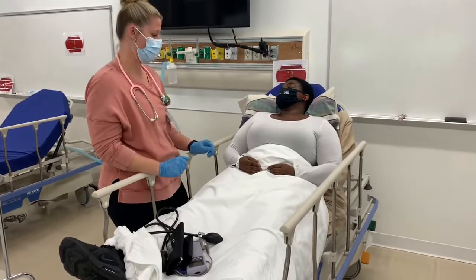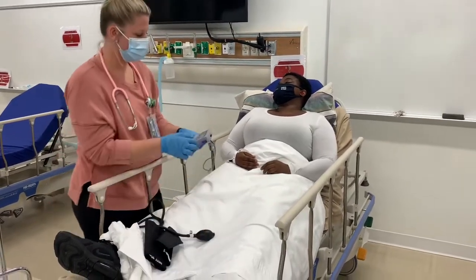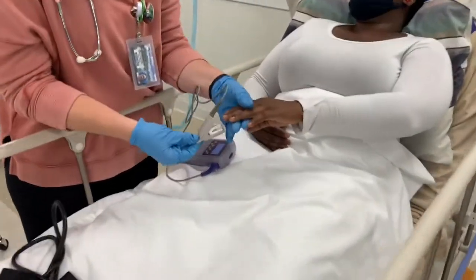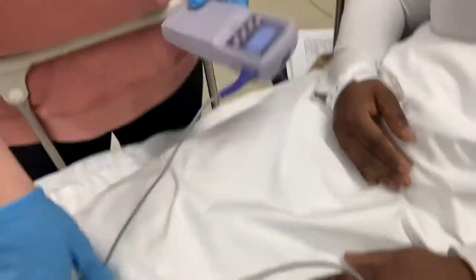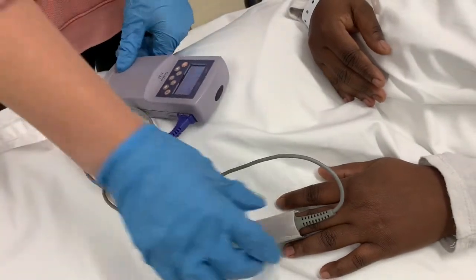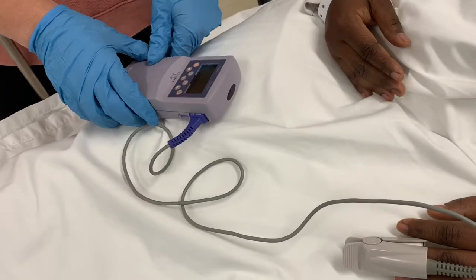Now you're going to move on to pulse ox. Miss Eddie, can I see your finger, please? We're just gonna put this on your fingers. Just gonna check your heart and your oxygen, okay? Correctly apply pulse ox to the patient's finger and assess the heart rate and the pulse. You can just leave your hand still and it'll read it.